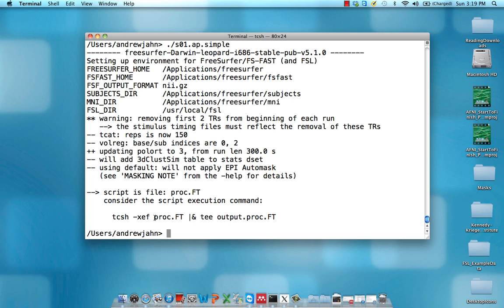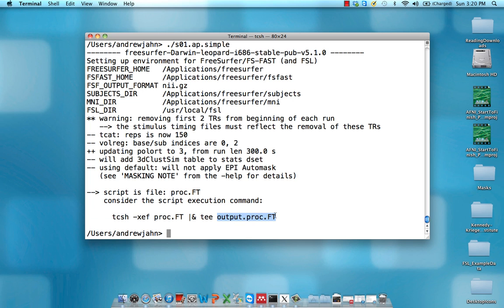It's going to say run that script, this proc.FT script we just generated, and then also pipe anything, both to standard output, standard error, and also shovel all that information into a file called output.proc.FT. That's mainly for debugging purposes.